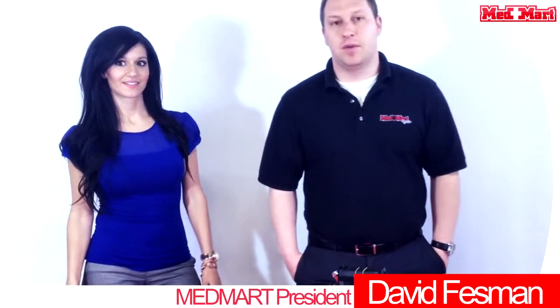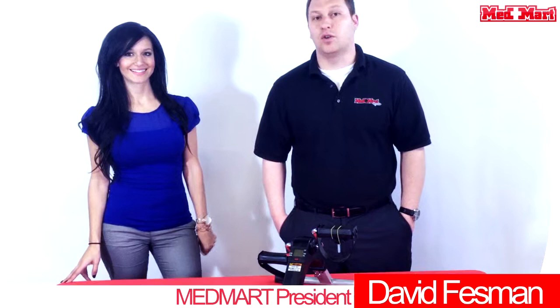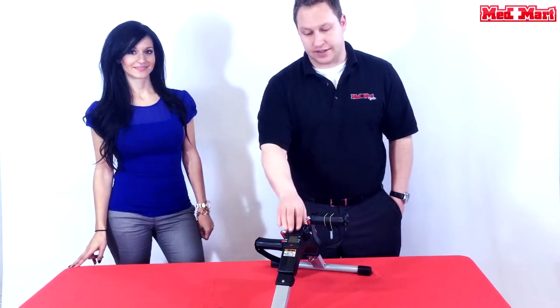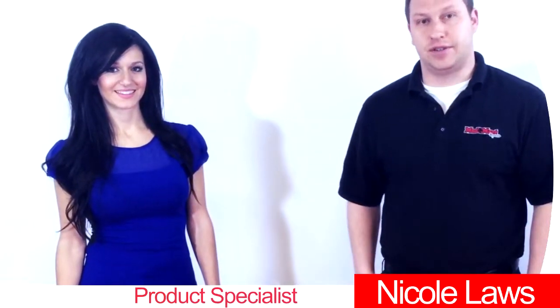Hi, David Fessman here with Queen City Med Mart based out of Cincinnati, Ohio. We have an online e-commerce store and local retail stores. I'm here to go over a new great product from Drive — it's the Exercise Peddler with Digital Display. I have Nicole Laws from Drive Medical to go over some of the features of this unit.